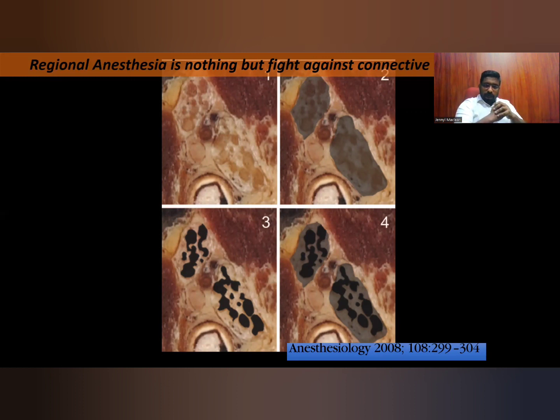If you want to call it a spinal anesthesia of arm, the ultrasound provides you information that you have a paraneurium around each trunk of brachial plexus. You need to dissect out the paraneurium of each trunk of brachial plexus and deposit the drug in the right place. That I will show you.